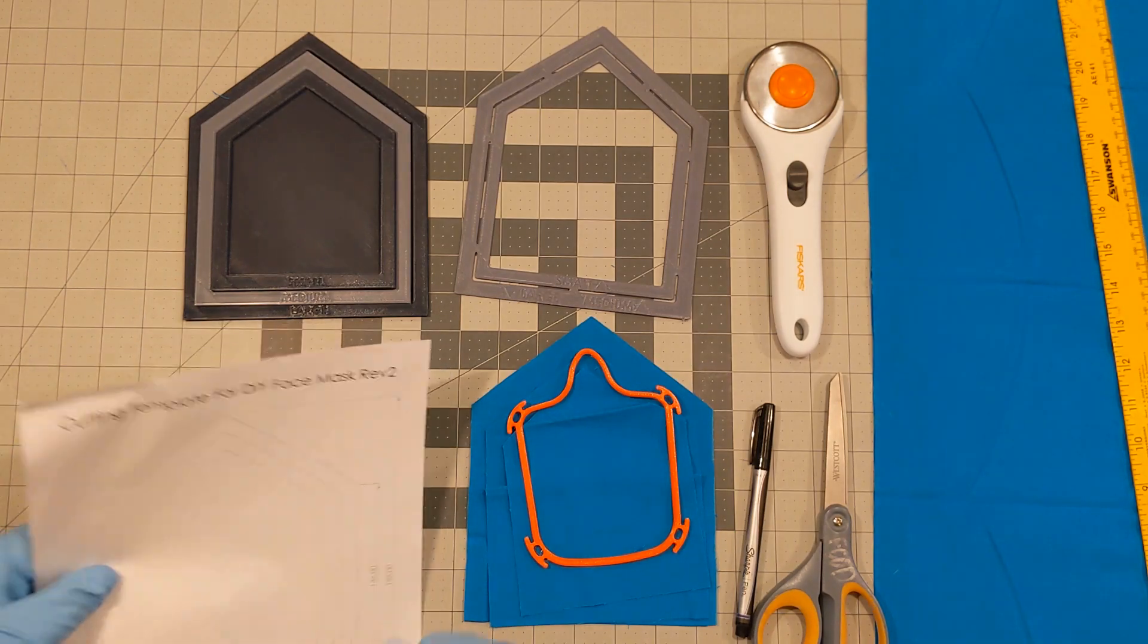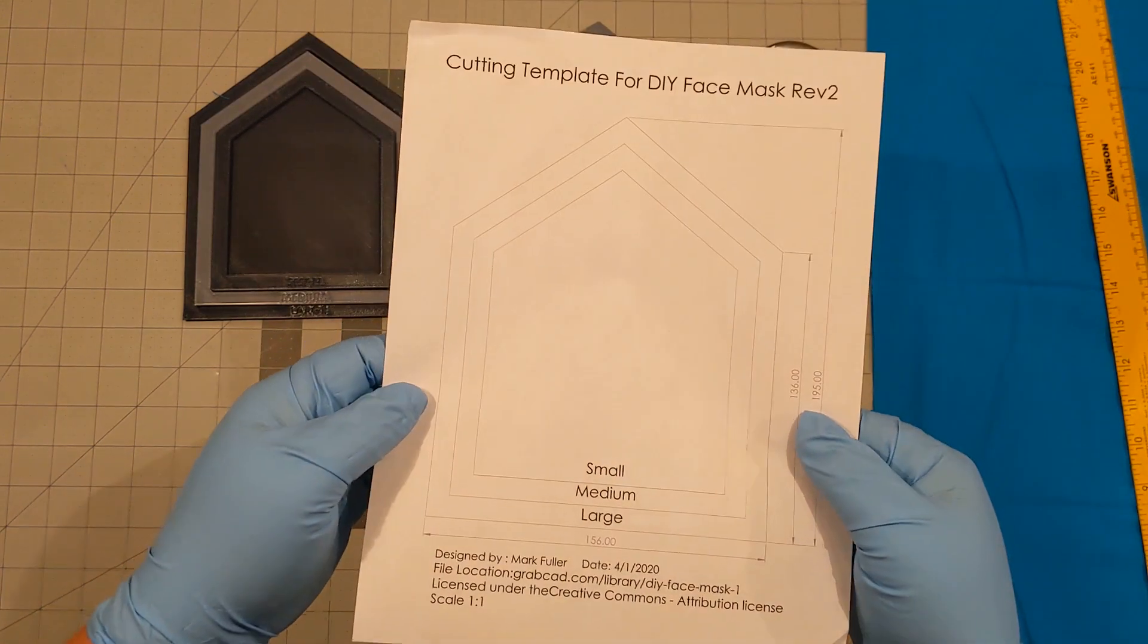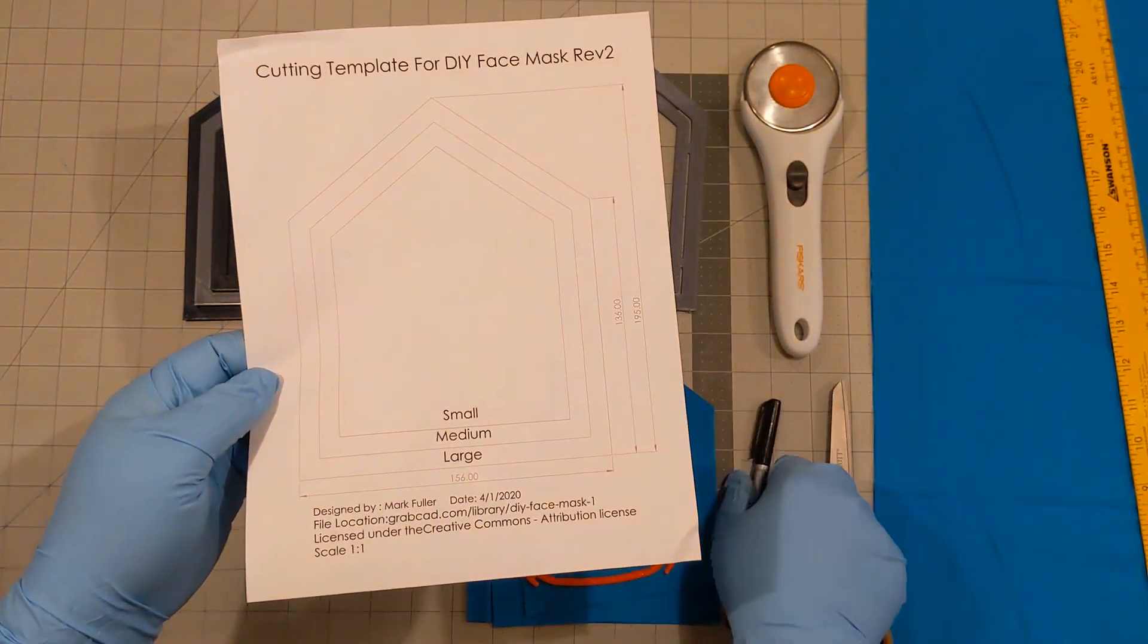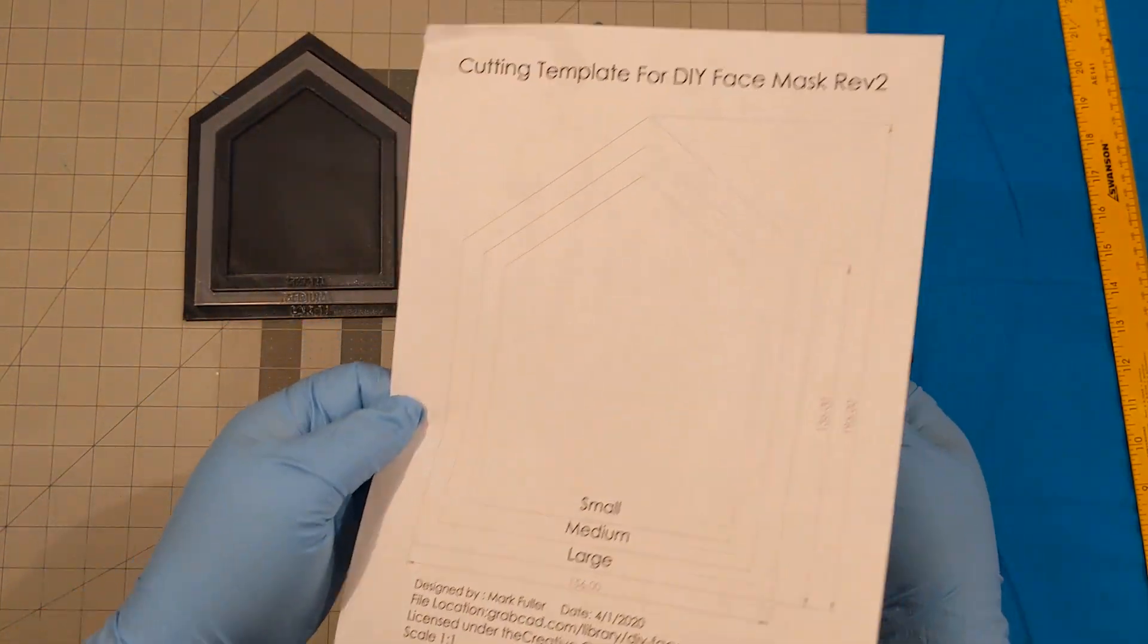The second way is if you don't want to print this out and somebody gave you a frame, you can print out this PDF template, cut it out the size that you want, trace and then cut out your filter material. So that's the second way.